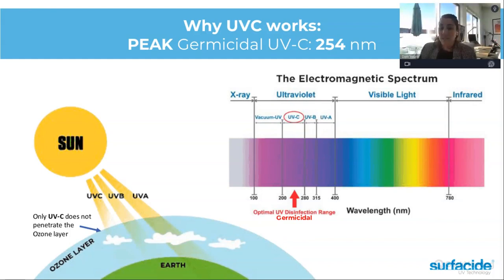What is the exposure time for UVC for hard surfaces? The way that UVC works is that the equation is time plus distance equals a dose.